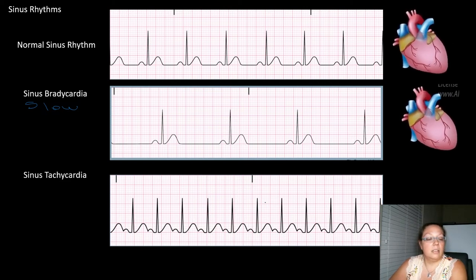1, 2, 3, 4, 5, 6, 7, 8, 9, 10, 11. So we got a heart rate of 110. So it's fast, so we got tachycardia. So tachy, here's our word tachy.